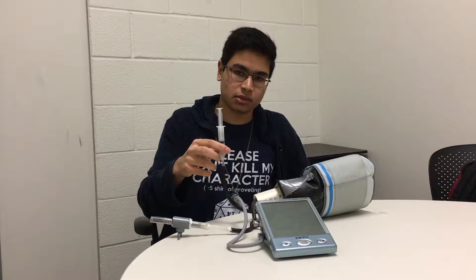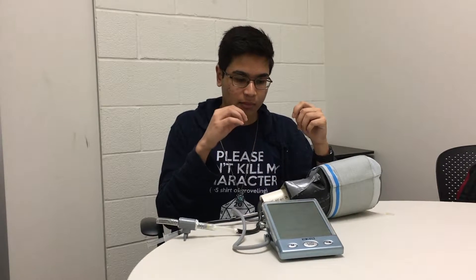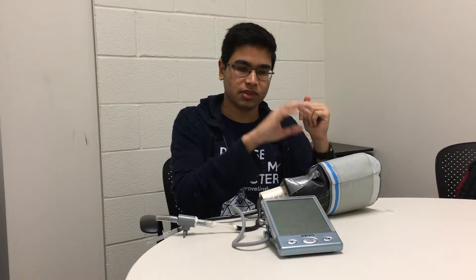The most important part is this syringe which is used as a pump in order to increase and decrease the water pressure, which simulates blood flowing through your veins. This increase and decrease in pressure stimulates the cuff and makes it think that it is around an actual arm.